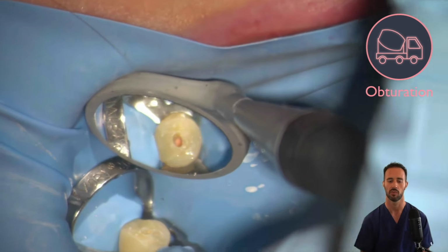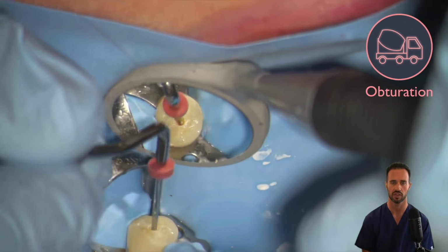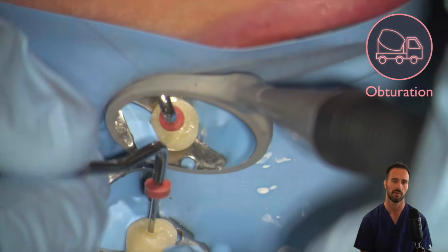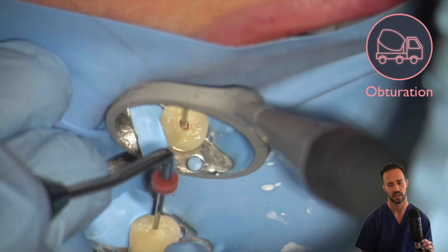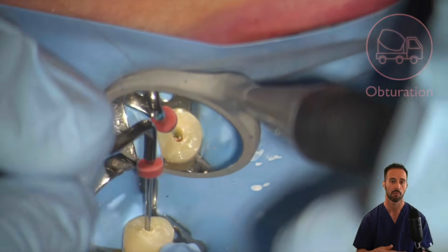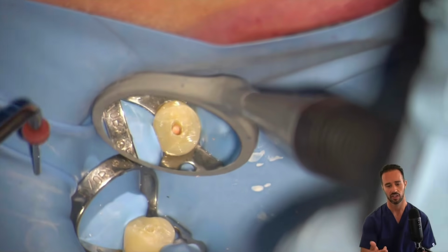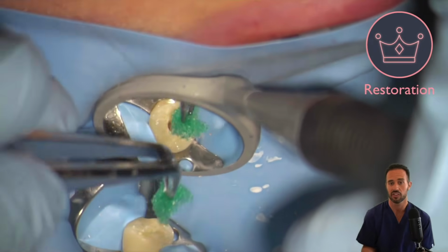And me as an endodontist, I'm going to be placing a provisional restoration or a temporary restoration, but I would encourage you, if you feel confident about the disinfection and the treatment, to go ahead and place your core buildup here. That's going to be a very, very profitable appointment, okay, because you're going to have the root canal treatment done in less than 20 minutes once you get good at this, and the core buildup done in just a few minutes more.